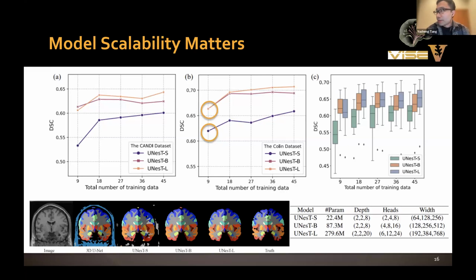Yes, I think it works for most of the tissues. But we know there is a very well-known public dataset called BraTS, which has brain tumor images and also contains the T1 weighted image. We can try that image for segmentation, but this model does not target tumor segmentation, so we do not include any tumor labels or ground truths in our training data. So I think it can hardly segment the tumor, including the three types of tumor labels.